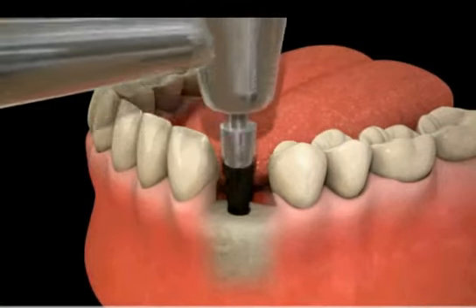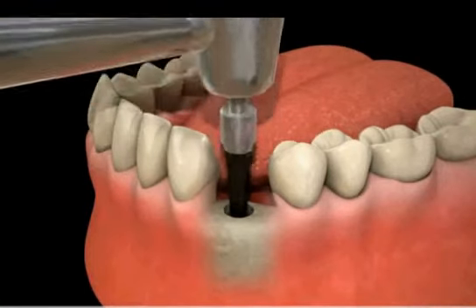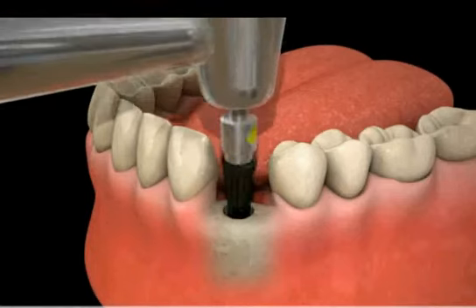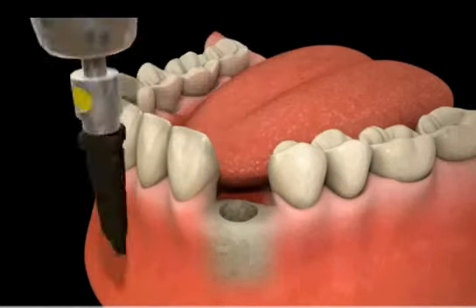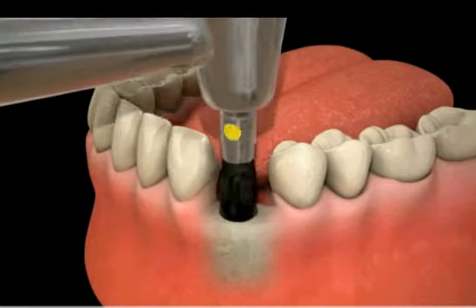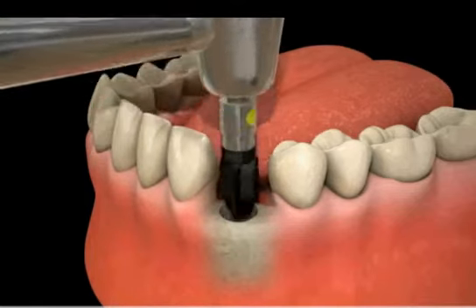Once the x-ray has been verified, the guide pin is removed and a series of several dental burrs are used to form the bone to the proper size for your implant. This procedure is quick and simple. In fact, it is very similar in sensation to getting a filling done in a tooth.